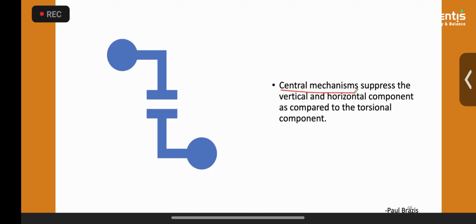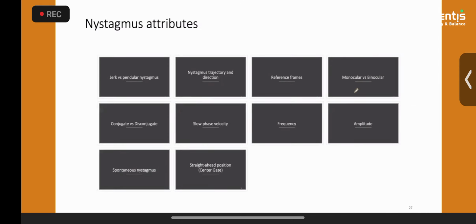That's why it is very important to remove the fixation and check the same patient, and then we can appreciate the vertical and horizontal components. So that's why it is so important that we check the patient without fixation. And with the help of video oculography equipment, it is very easy to put the flap, that visor, and that helps to block the fixation.